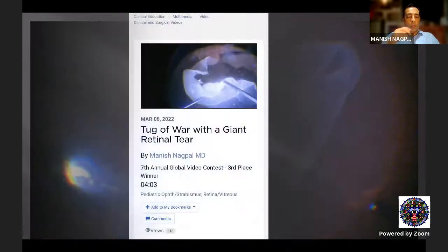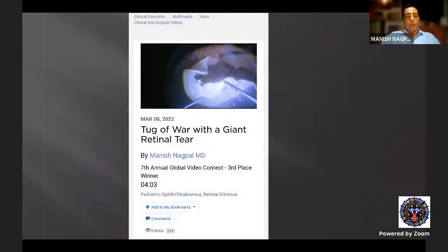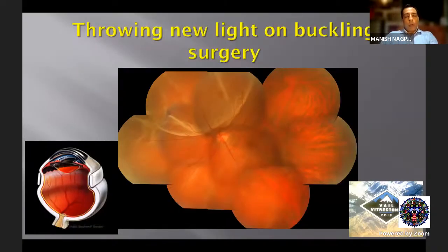So this video actually last year won the 3rd place in the American Academy's global contest on challenging cases. Now, let me take you quickly to a few cases of buckling, which we do in a certain group of cases, especially young children, dialysis, those kind of cases.